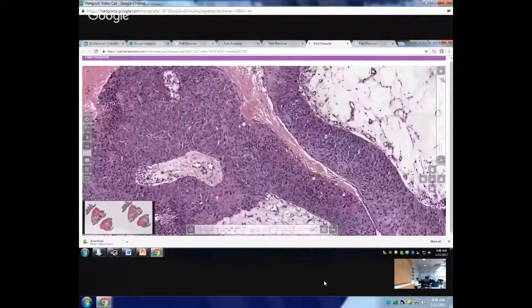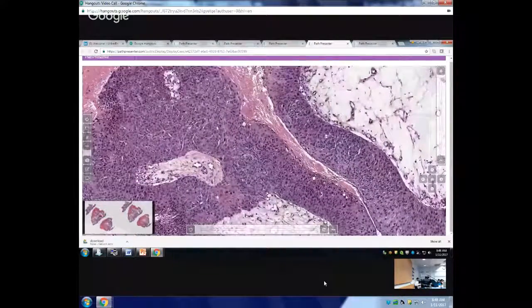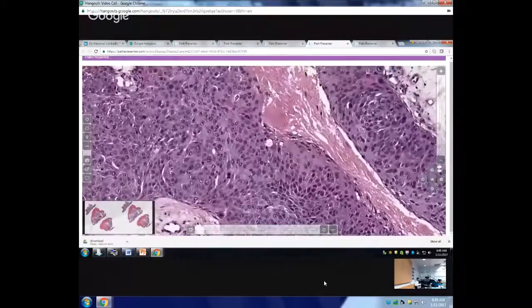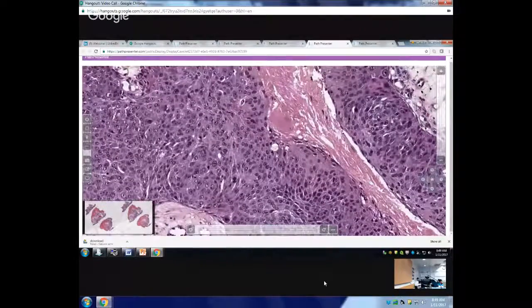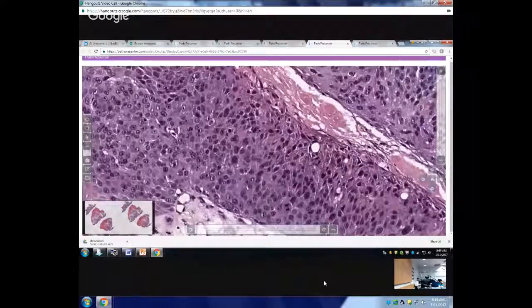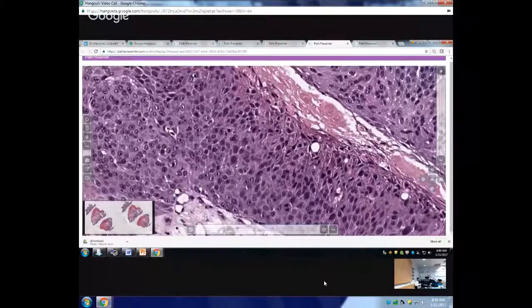So, there's a duct here. There's another duct here. There's another duct here. There's another duct here. So, all these are ductular structures. And they're usually lined by cuticle. So, the CEA highlights the cuticle of the duct. So there's a cuticle here that is highlighted by the CEA.